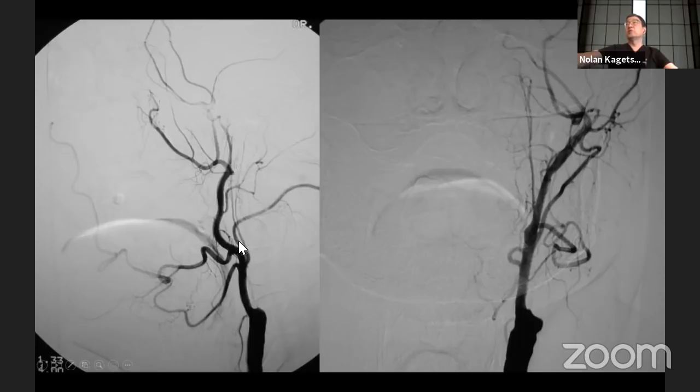O is occipital. So this is anterior, this is posterior. So this is going posteriorly to the occipital region. And it's harder to see on the frontal view. And P is posterior auricular. You hardly ever see posterior auricular on any imaging, so that's probably one of the reasons I save these images. This is the best example of the posterior auricular I've ever seen anywhere.